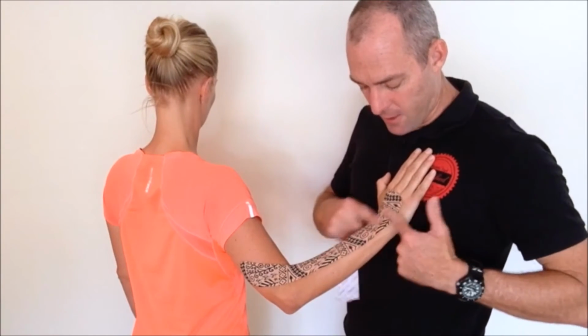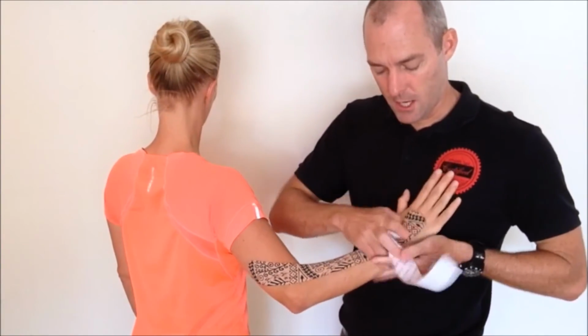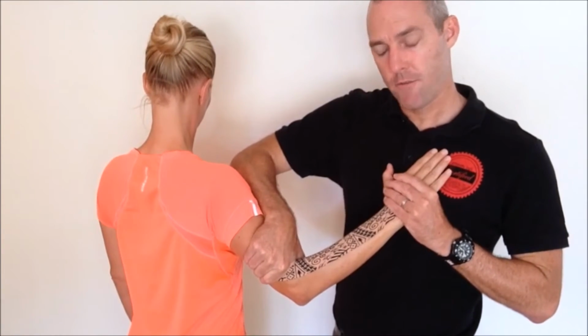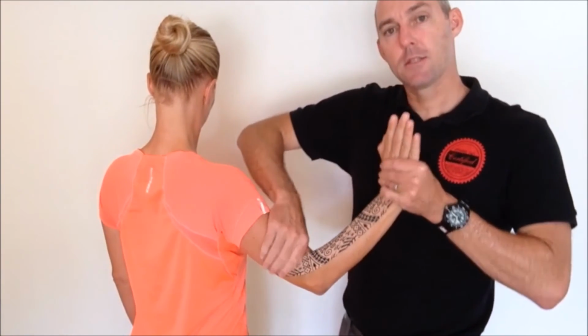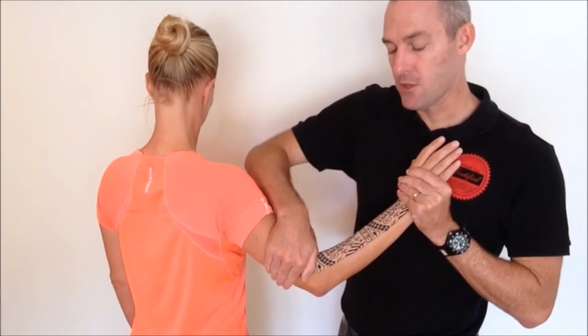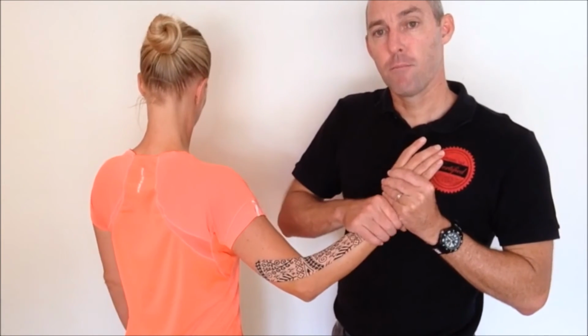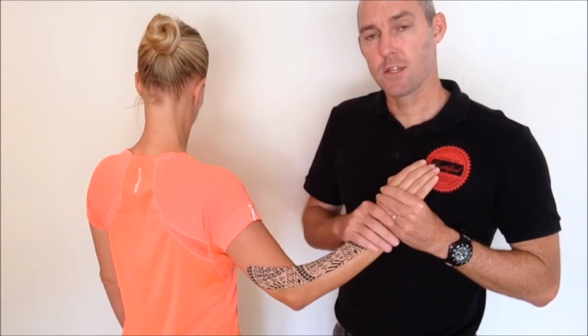But for these, now that we've done this, sure, we can now bring it down and make sure that it's well adhered and hold that well in those hollow areas. Press and hold once again for that good adhesion on the ends. But don't start with the ends and then come down, or you just get far too much pressure on there because of the force in this tape, and you're going to get either reactions or it's going to come off due to that excessive shearing.